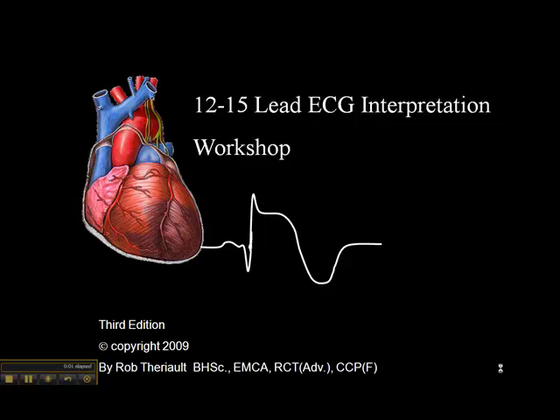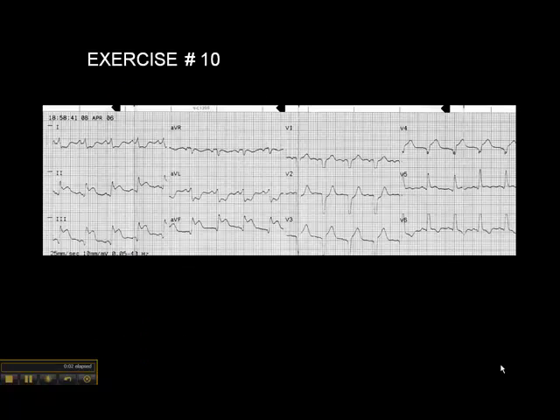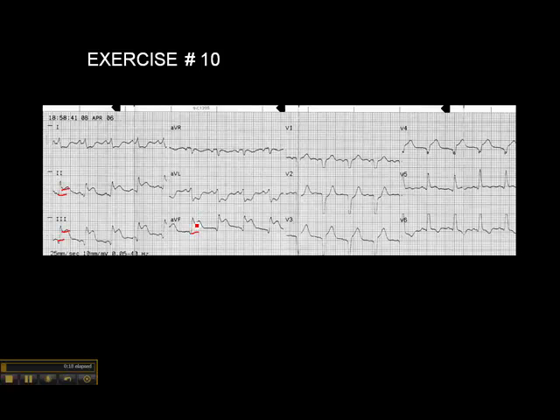We're on exercise 10 on page 48, and we'll go through this in a step-by-step sequential manner. Starting with lead 2, there is definitely ST elevation in lead 2. We definitely have ST elevation in lead 3. We have elevation in AVF, so we suspect an inferior wall MI for sure.